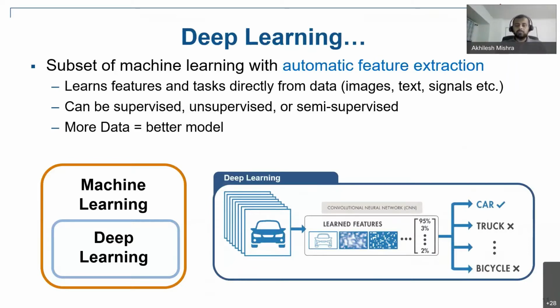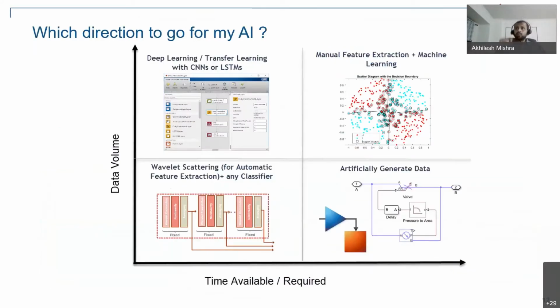And with many layers, it's hard to predict, explain the predictions, understand the model, and then harder to verify and validate it to actually put in a medical device. But still, it is very powerful, and people have been doing that. So in this retrospect, the question comes in which direction should we go for our AI?